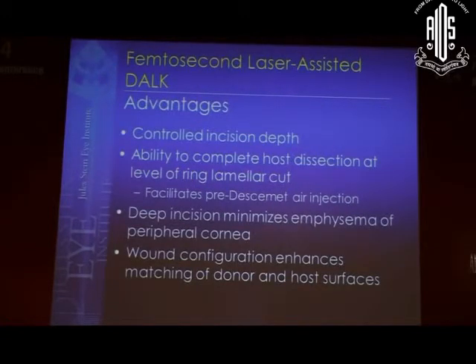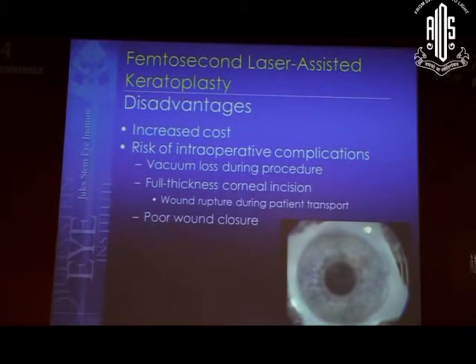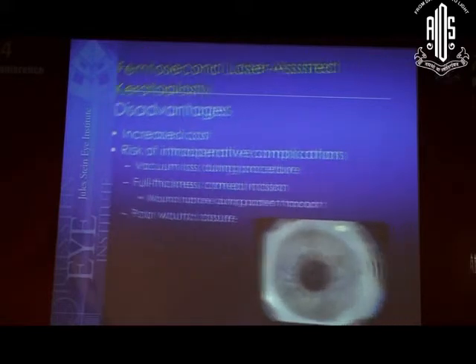In my hands, it really facilitates DALK because it gives me a very controlled incision depth. The very deep incision minimizes emphysema of the peripheral cornea, and the wound configuration enhances matching of the donor and host surfaces. It does have disadvantages. It's more expensive. You can risk vacuum loss, full thickness incisions, and poor wound closure, as I've showed you.